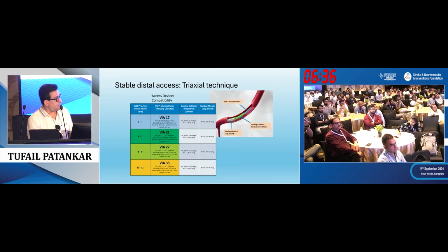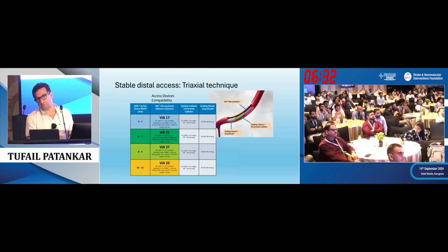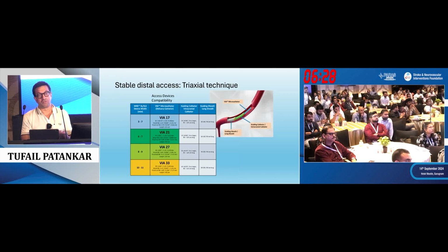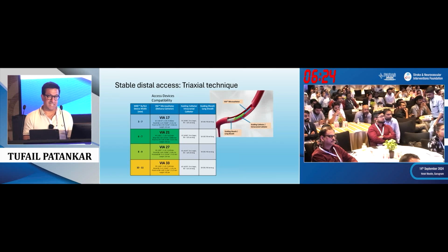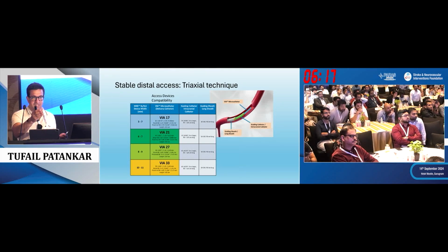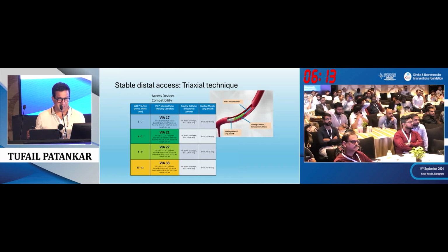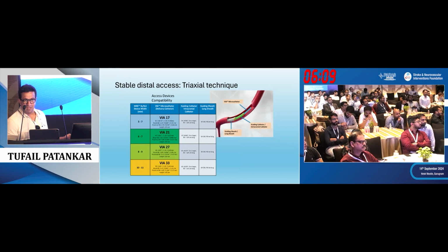So here normally again, I always use triaxial system. I am probably very conservative in that way. I have a younger colleague who uses Benchmark for flow diverters, Benchmark for everything, but he has problem that I don't have. Okay, so in Britain everybody is different, so you don't have like the German and the French system. The boss tells you what to do and everybody does that. In Britain everybody is a boss. Okay, so I don't care who has a problem as long as I don't have a problem.